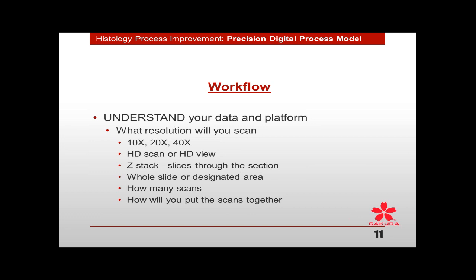And then how will you put the scans together? This is no different than assembling your case of glass slides in the flats. You have to assemble that case and get it to the pathologist with the appropriate patient information. You also have to understand how you're going to do that digitally.